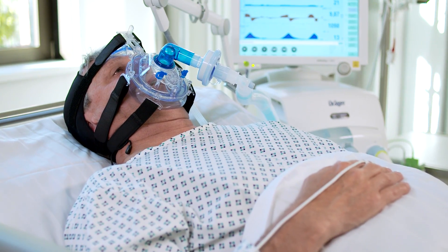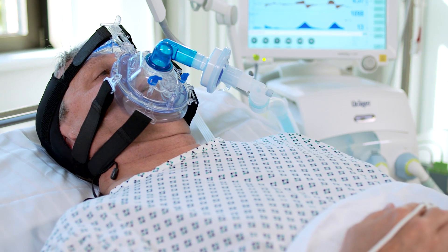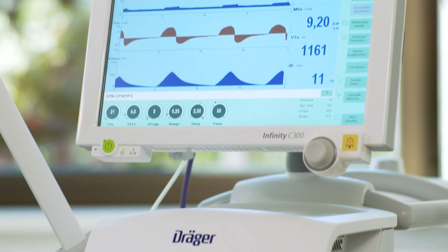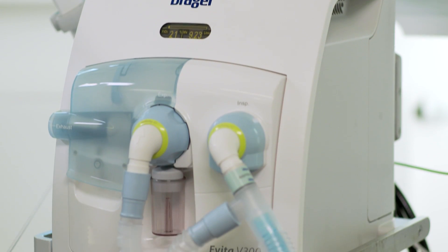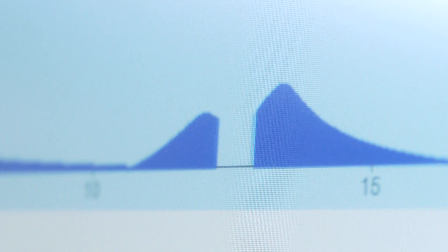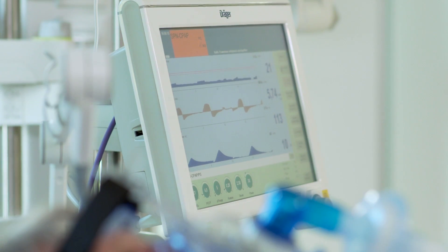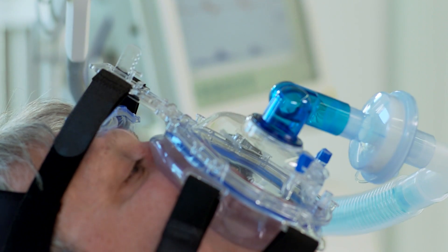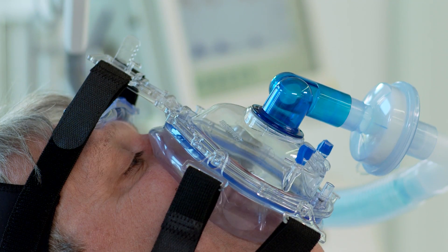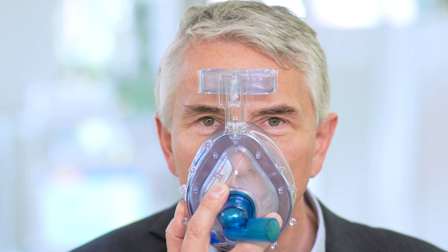Und wenn das Beatmungsgerät einfach in einem vorgegebenen Rhythmus auf den nach Luft schnappenden Patienten einpusten würde? Das wäre alles andere als angenehm. Darum ist es wichtig, dass das Beatmungsgerät die Atmung des Patienten erkennt und seine Einatmungsversuche unterstützt. Anders als bei einem Traumapatienten ist dieser Patient wach und ansprechbar, aber erschöpft und seine Atmung ist sehr flach. Um eine Intubation zu vermeiden, verwendet der Arzt eine Gesichtsmaske — dieses Verfahren wird nicht-invasive Beatmung, kurz NIV, genannt.